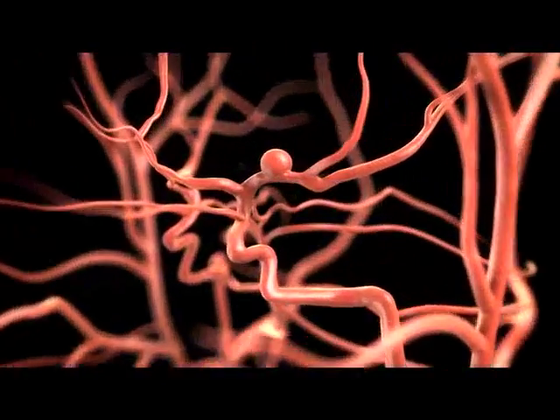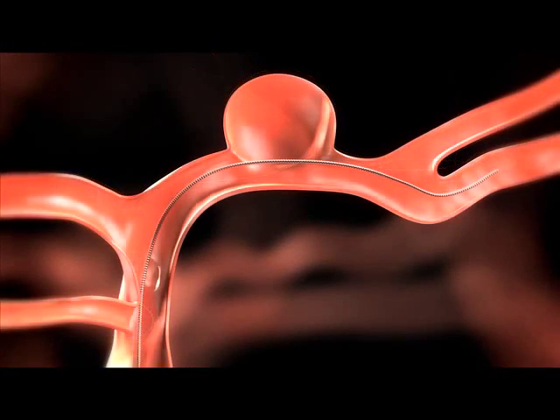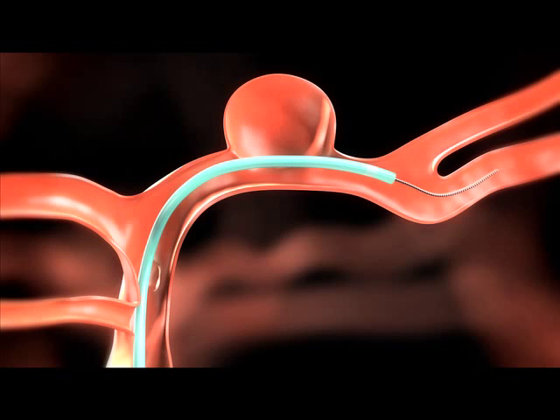With the aid of a suitable guide wire, hold the guide wire in place and advance the micro catheter until the end of the micro catheter is positioned so that at least four millimeters of the Solitaire AB will extend past each side of the aneurysm neck along the parent vessel when fully deployed.